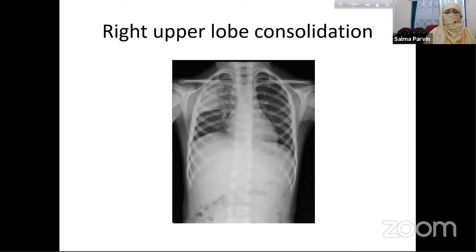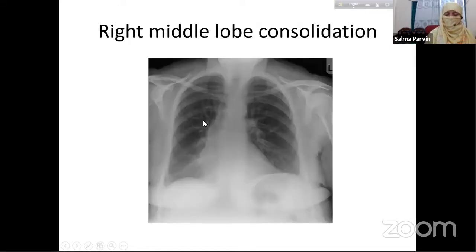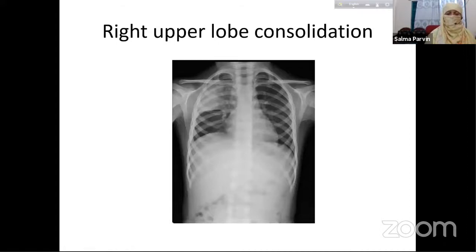The visibly important mentioned objects here should follow; you must very carefully go through that. All those things are present here, like a large consolidation, a small effusion, and probably this patient may have some sort of respiratory distress also. Even then, there is no mediastinal shift.